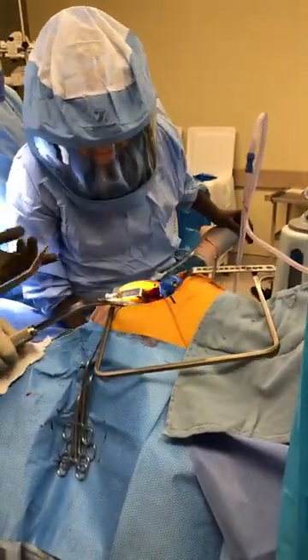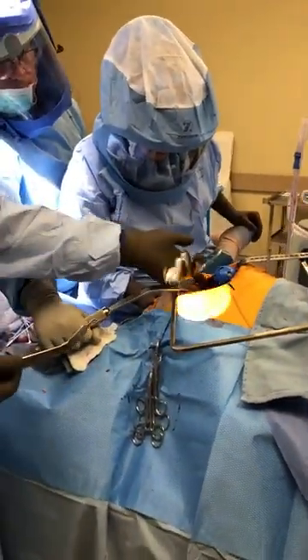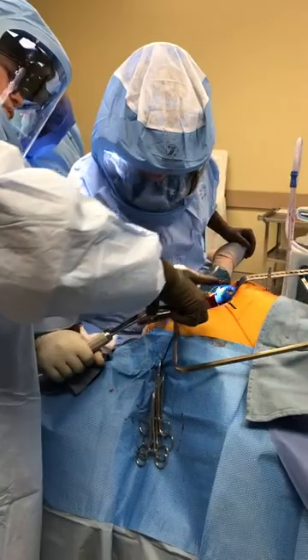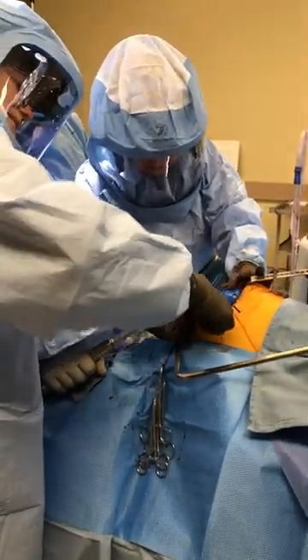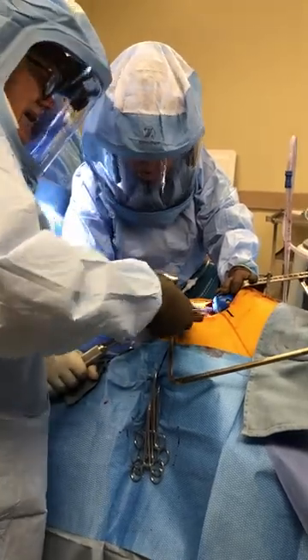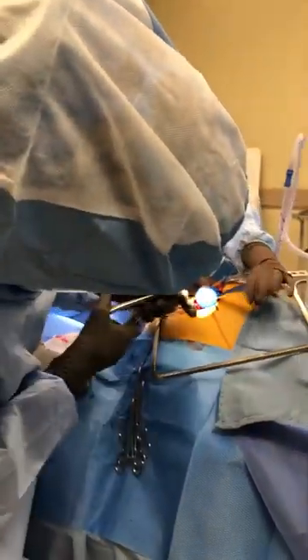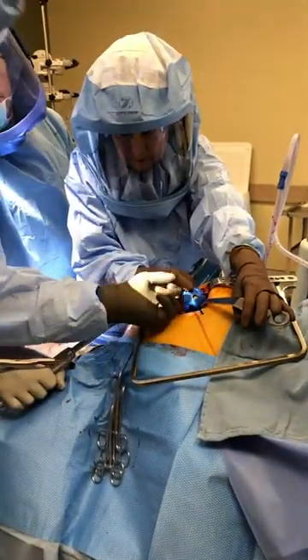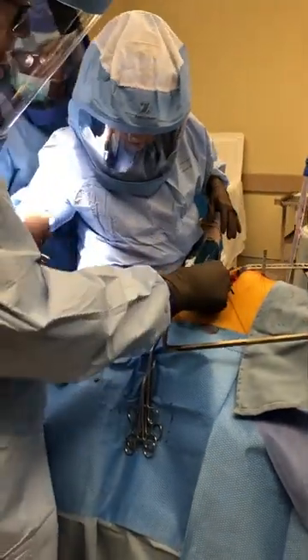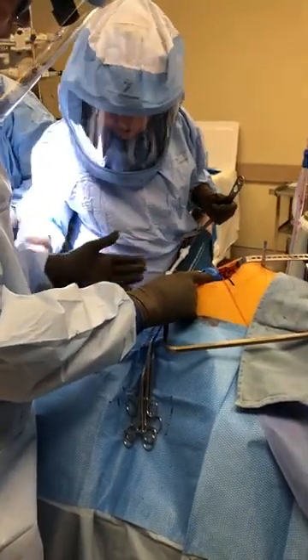Now we're going to look for anterior osteophytes. We tilt it up a little bit more. Notice the leg at 45 degrees. When you have it not at full flexion, you can internally rotate it safely — it won't hurt the nerve. I can use the edge of the implant as a guard to trim off any anterior osteophytes. If you had a cam lesion, you would take it off at this point, but he doesn't have one. Great anterior offset — basically unchanged from his previous. I don't take much off posterior unless it's really gigantic; I leave that alone because it's not going to impinge into anything.